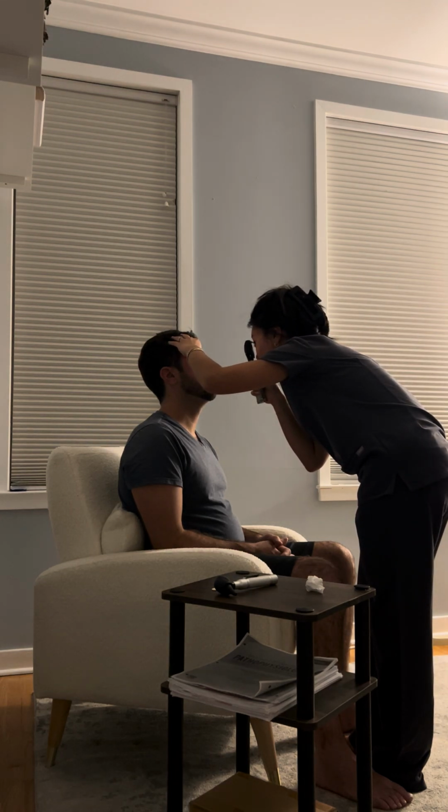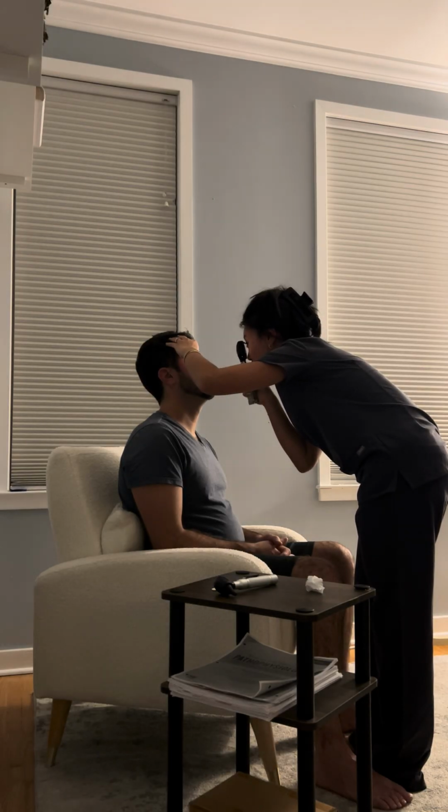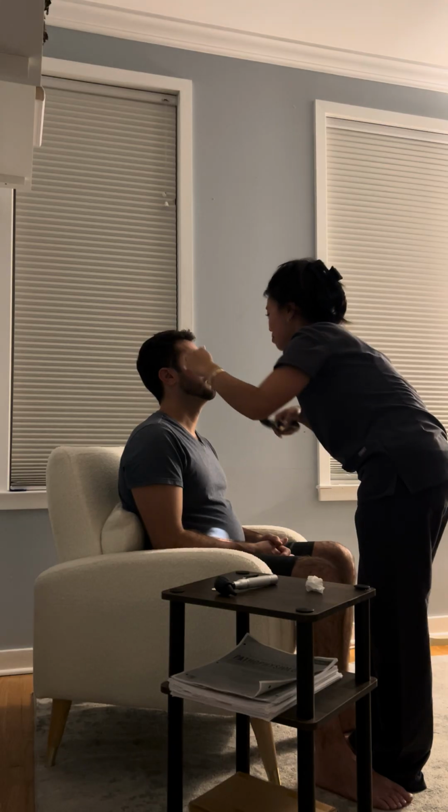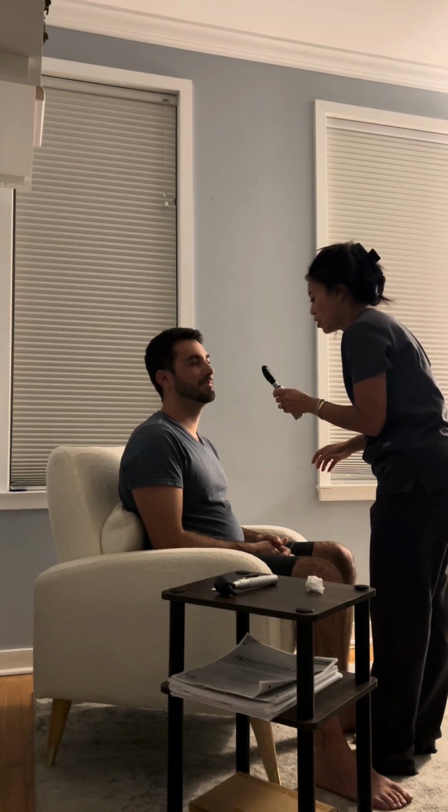Checking for the red light reflex, looking for the cup and disc. Then I'm going to move lateral to look for the fovea and macula. Good. You can have a moment. I know, I'm sorry. Okay, I'm going to do the same thing on the other eye.